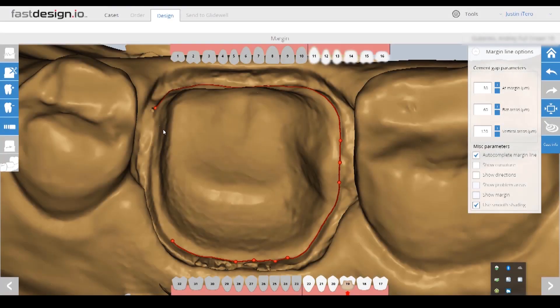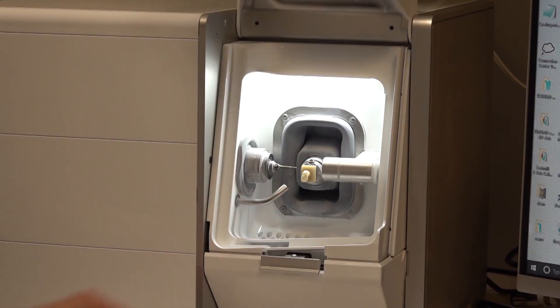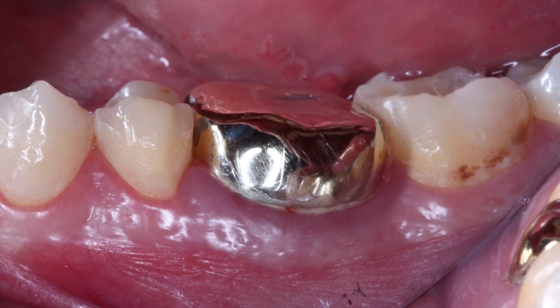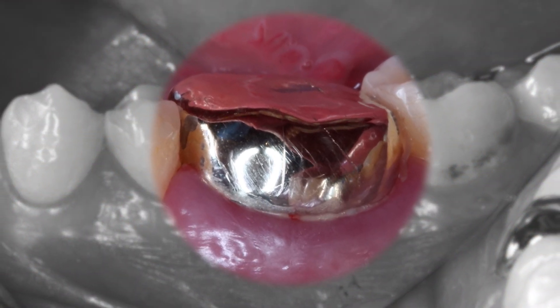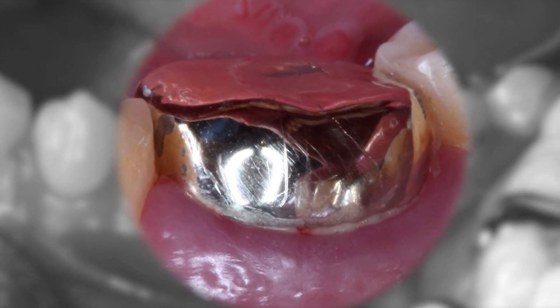I spend no more than three minutes marking the margin and designing the restoration. In only 35 minutes, the fully electric fast mill completes the crown. I'll take you through the easy process of using the Glidewell.io CAD/CAM system to fabricate a Bruxer crown chairside.